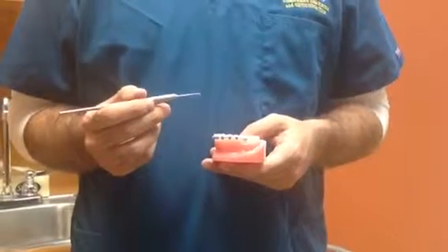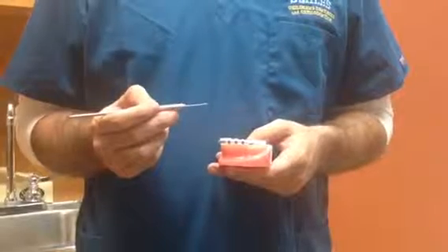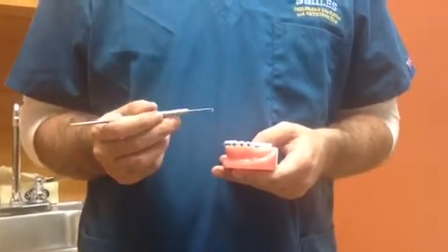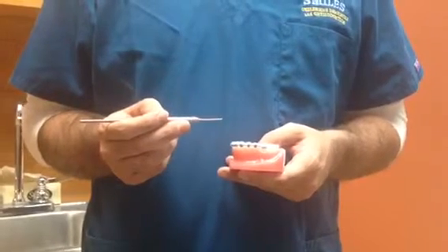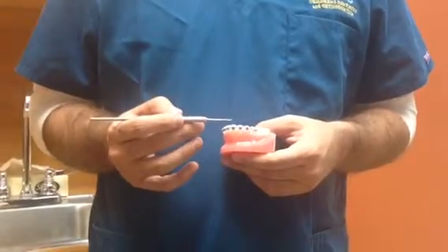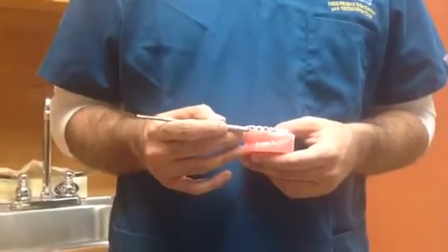Okay, Connie, we're going to show you how to remove your power chain. We can start with a tool like this. It's kind of like a little hook. You can find them in drugstores or even dollar stores. They don't have to be metal, they may be plastic, but whatever, you can have a little hook that can go through the power chain.